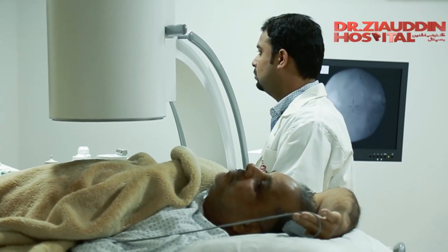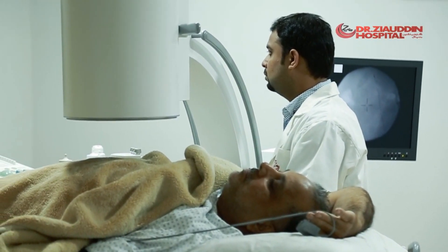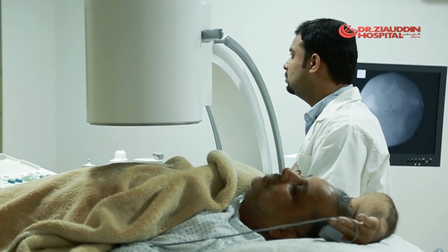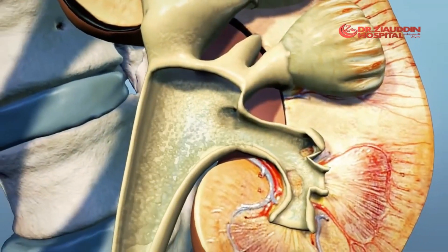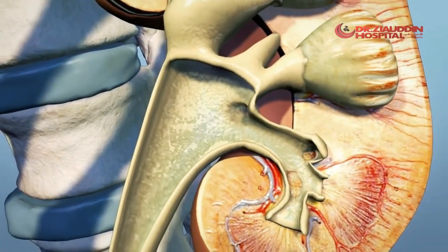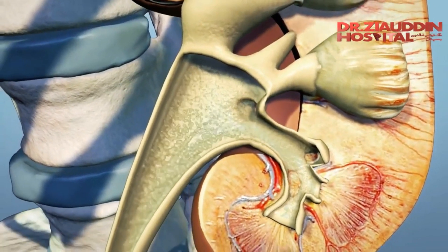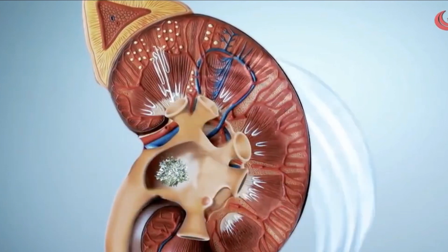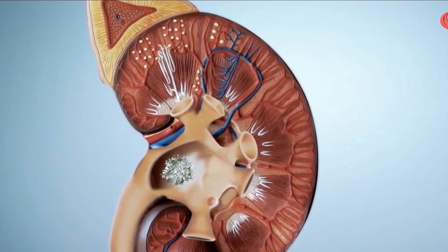Ultrasonographic localization allows visualization of both radio-opaque and radiolucent renal stones and real-time monitoring of lithotripsy. Most second-generation lithotriptors can use this imaging modality, which is much less expensive than radiographic systems. Although ultrasonography prevents exposure to ionizing radiation, it is technically limited in its ability to visualize ureteral calculi, typically due to interposed air-filled intestinal loops, and small stones may be difficult to localize accurately.